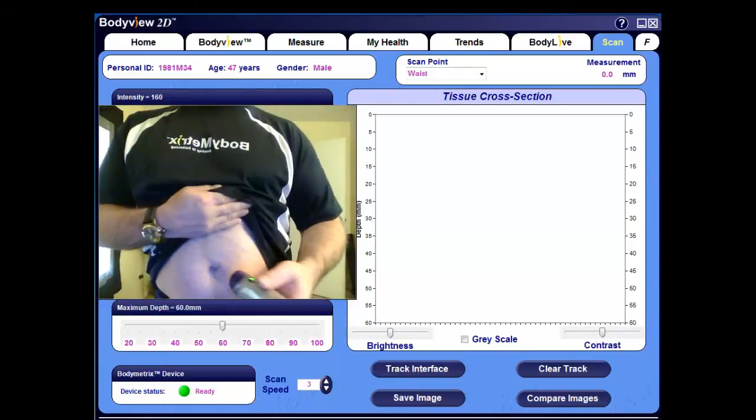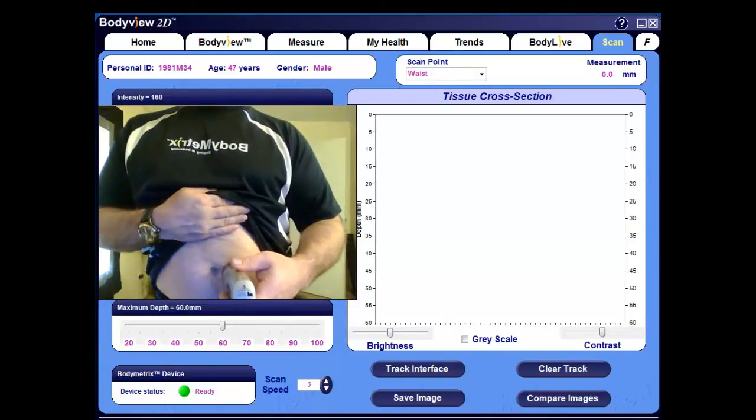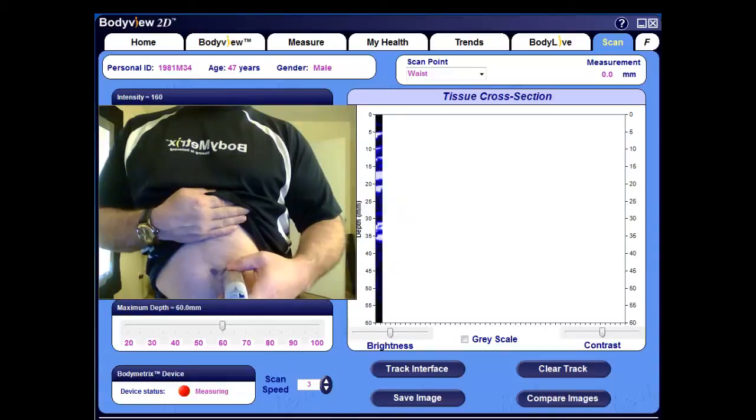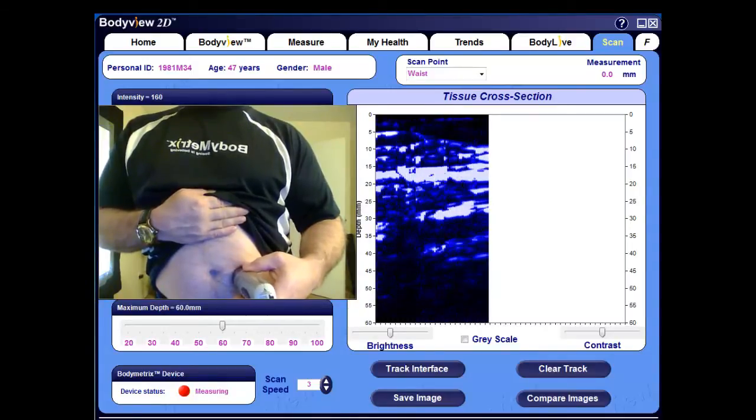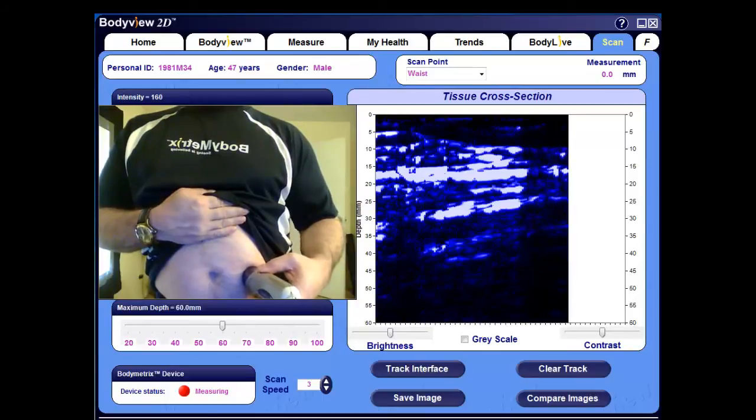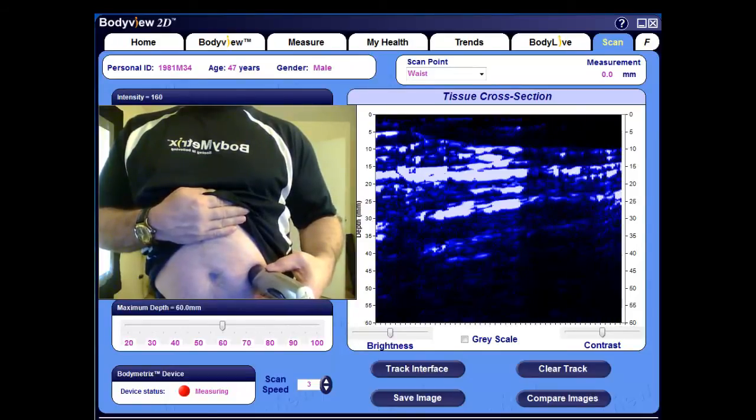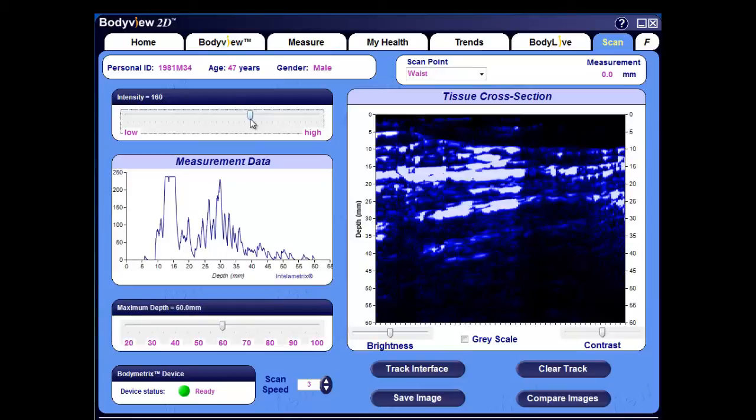When you're ready to start the scan, go back to your starting point one inch to the right of the belly button, press the button on the BodyMetrics device, and slowly drag the device in a smooth fluid motion three to four inches towards the right side of the body, making sure that the device is flush and perpendicular on the skin. This should take approximately four to five seconds.